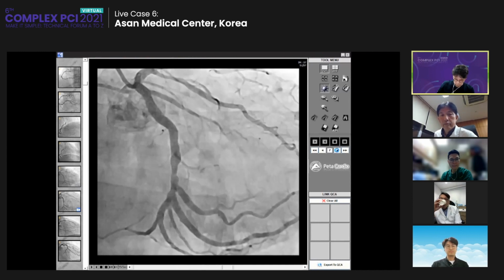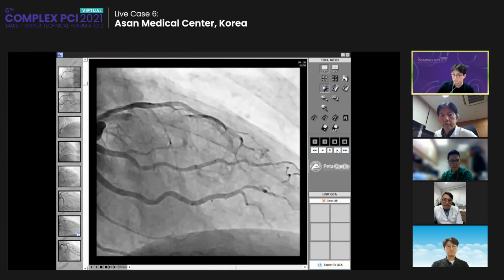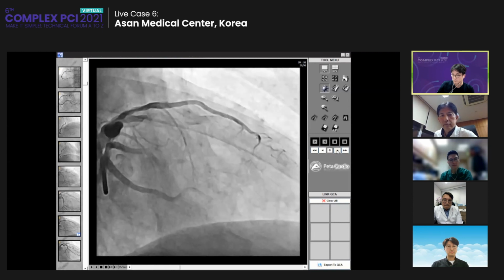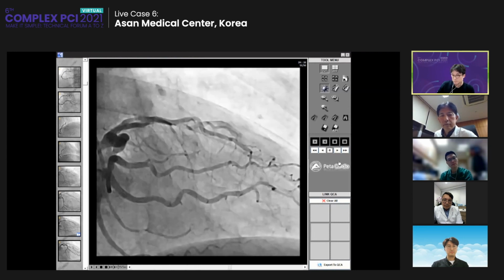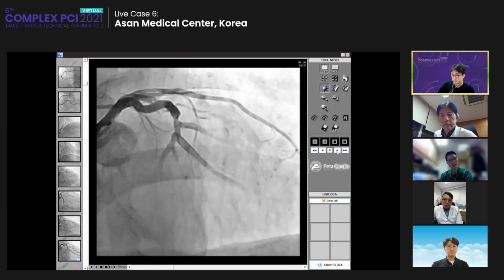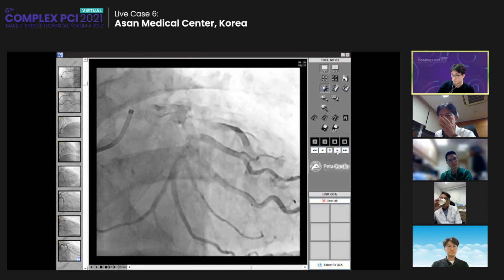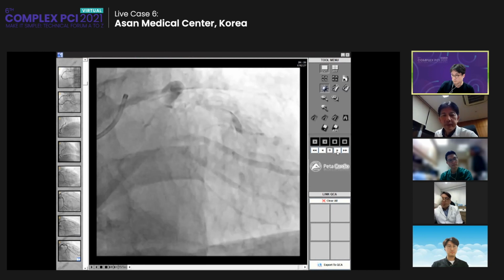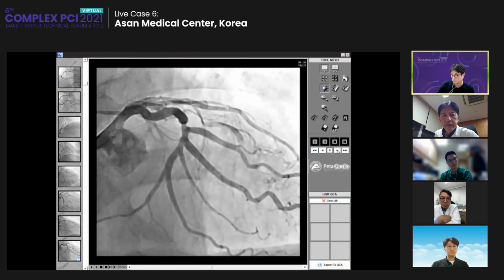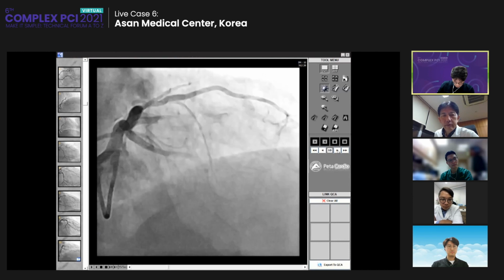Now, this is a cranial view, and just looking at the left angiogram, it's not quite possible to assess the morphology of the distal cap in this view. But according to the right coronary angiogram, the distal cap is located just at the big septal, so we assume that there is a bifurcation at the distal cap, which is not a good signal for reentry.